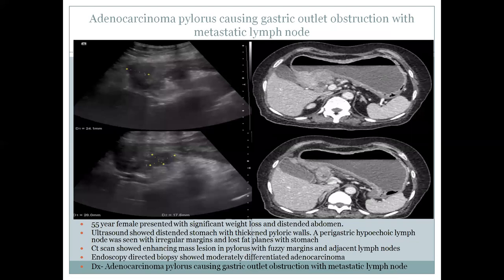A 55-year-old male patient presented with significant weight loss and distended abdomen. Ultrasound showed a distended stomach with thickened pyloric walls and abnormal gastric mucosa with loss of normal fat planes. CT scan showed an enhancing mass with spiculated margins. Endoscopy-directed biopsy showed adenocarcinoma, and this patient presented with gastric outlet obstruction and metastatic lymph nodes.